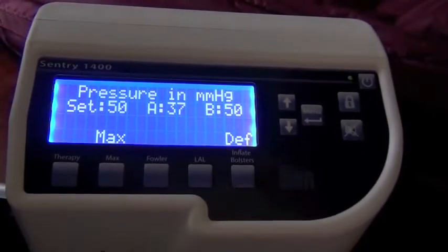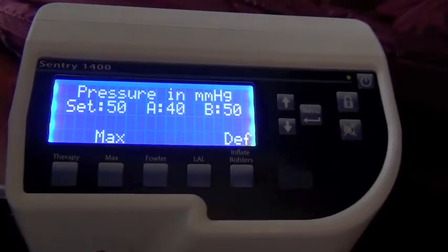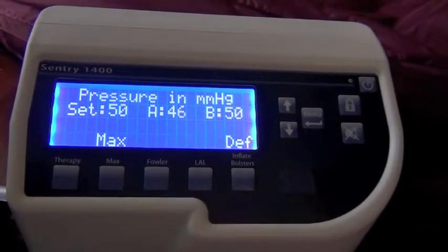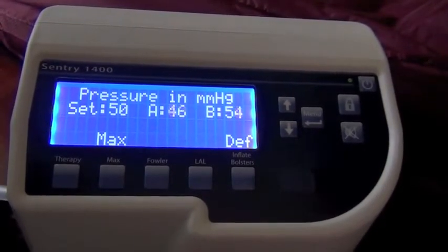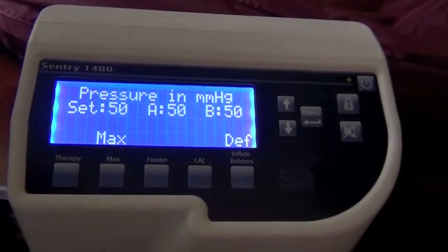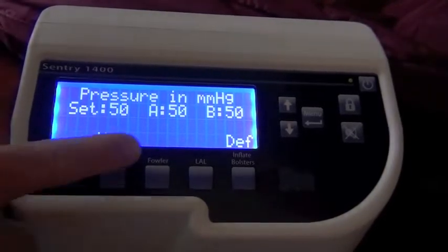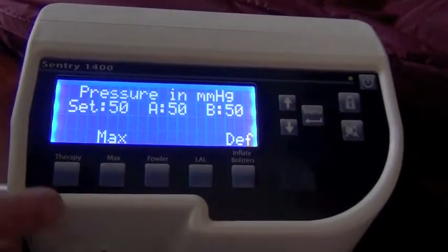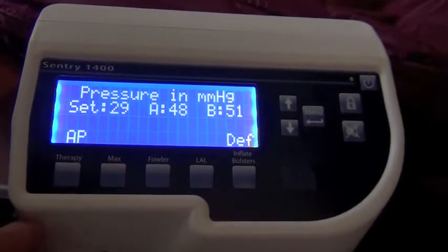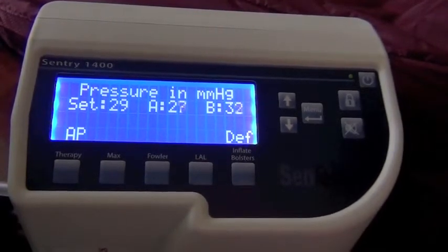It may be used for a procedure where you want a stable surface like an LP, or if you're putting in a central line, or intubation, something like that. But generally speaking, where you don't want an alternating surface to interfere with a procedure, we would go to Max. And Max will stay in this mode for 30 minutes, and at 30 minutes it has a fail-safe mechanism that kicks it out, and then we resume the pressure that is underlying.